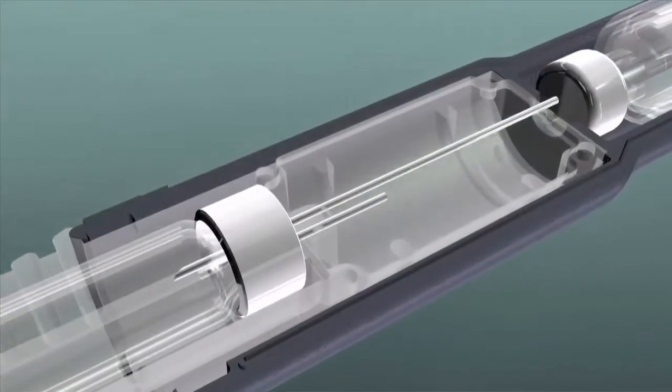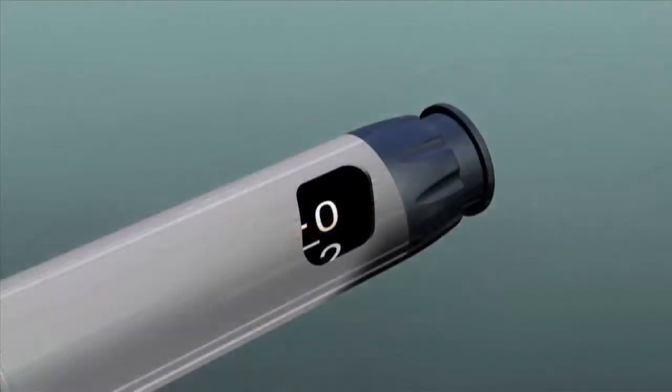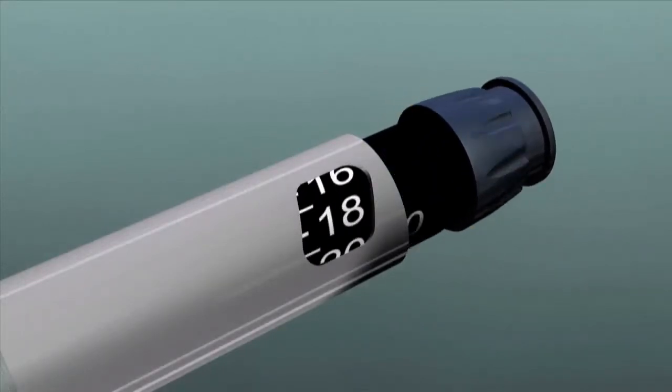The Onset mixing pen is a high-precision dispensing device that allows practitioners a way to precisely and safely buffer anesthetic in the operatory room just prior to injection. The pen's cartridge chamber hosts Onpharma's sodium bicarbonate cartridge.